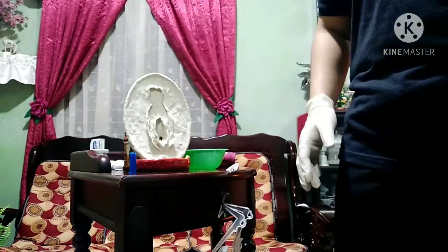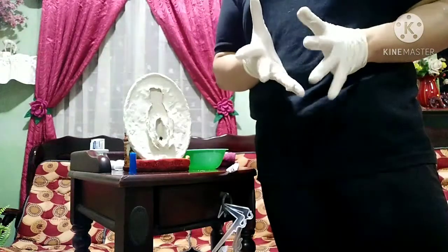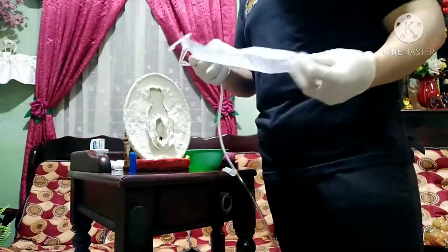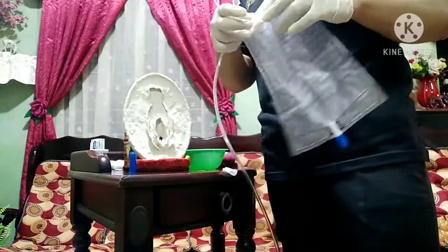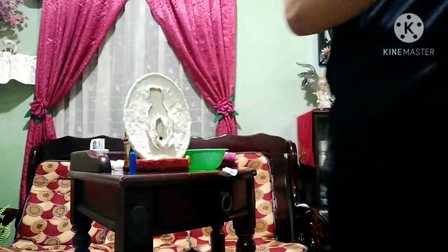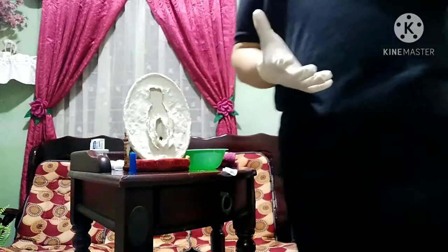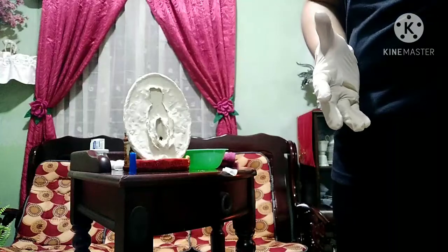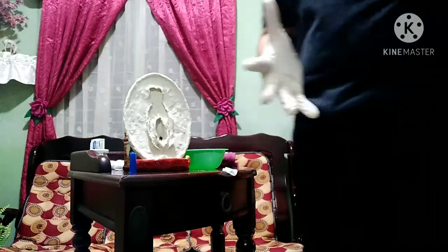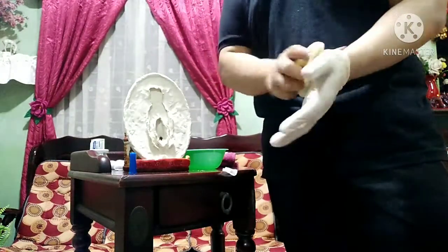Next step po is empty the drainage bag. Measure the amount of urine recorded and intake and output po. So, i-record po natin kung gaano po karami yung urine niya po. So, ayun po. I-record po natin lahat po. So, 7 po is remove gloves. So, ito po, remove gloves and wash your hands po. So, i-remove na po natin siya.